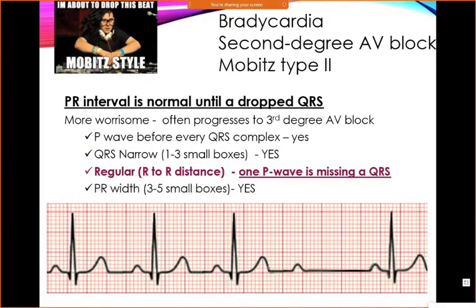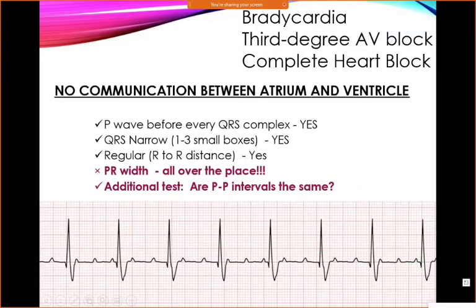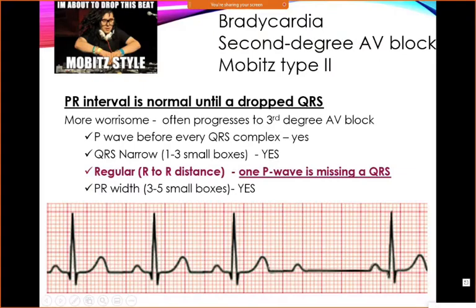This one is a second degree type 2. It's a little bit more serious. This one really does have a dropped beat. It's not longer and longer. What you see here is your rate. We're going to call this one a rate of 40, so we definitely have to name this one.